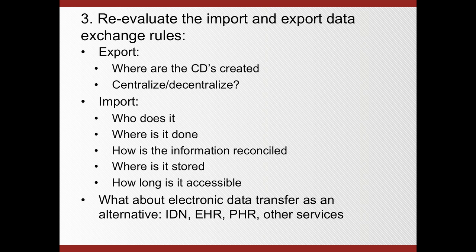And make sure that they're all 200% compliant. What I mean with 200% is make them more compliant than they would need to be. So make sure that they're as compliant as they can be. Because in many cases still, there are CDs created that might not necessarily meet all the different requirements of the DICOM interchange standard. And so the last thing you want to do is send your patients home with a CD, and then they go to another location, and the other location has trouble reading them in because they're not quite yet compliant.